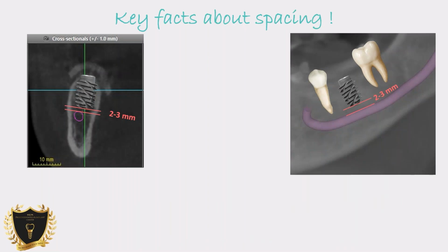You always have to remember, some experienced surgeons will say, "Yeah, I like to be within 1 millimeter." If you're doing any guided surgery, literature says there is always a discrepancy of a millimeter. So you have to keep that in mind.